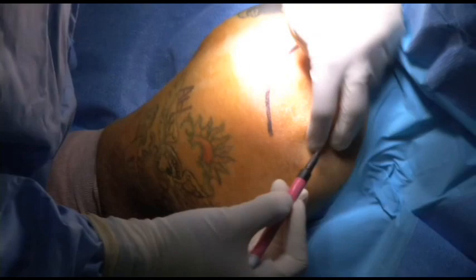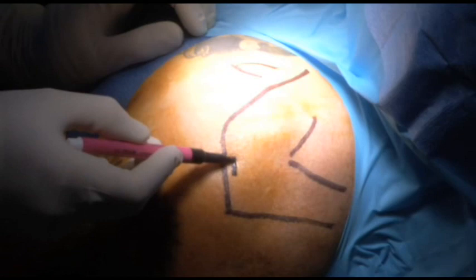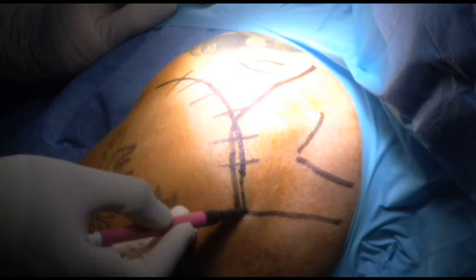We're marking our bony landmarks, which is key for a fracture so you know where you're at. There's the coracoid process right up here. We're going to make a transverse incision off the edge of the acromion, and we can extend that to a deltopectoral approach if we have to.